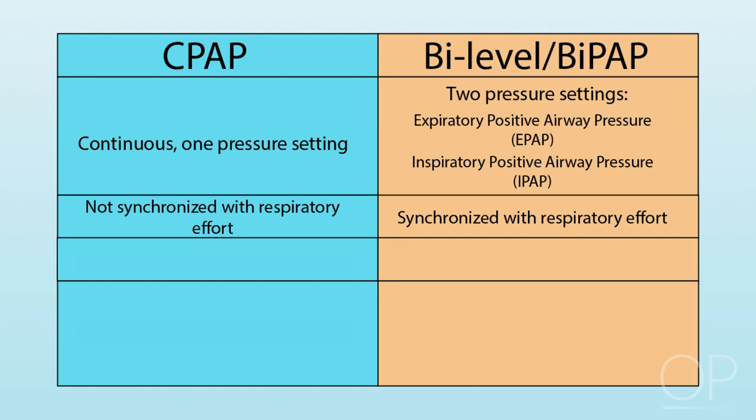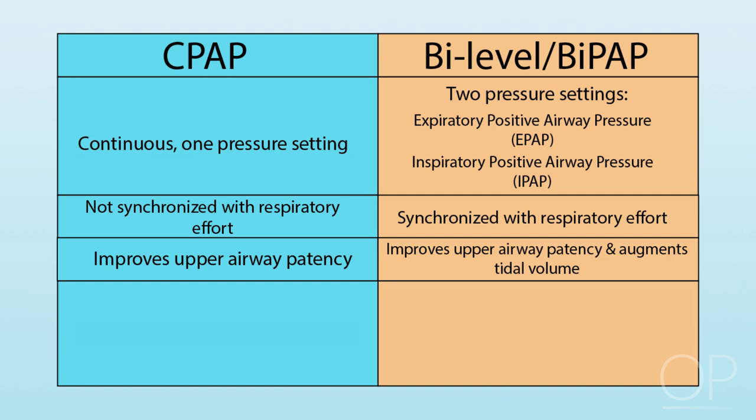It improves, similar to CPAP, upper airway patency. And also, in addition to improving your upper airway patency, it augments your tidal volume. It delivers a bigger breath, which is the most important feature of bi-level ventilation compared to CPAP, which typically does not augment your tidal volume.